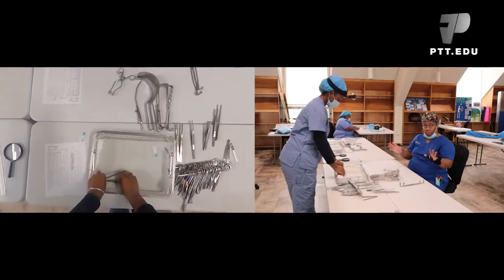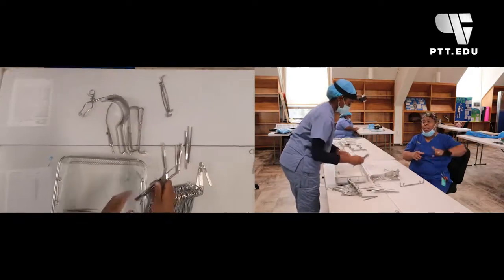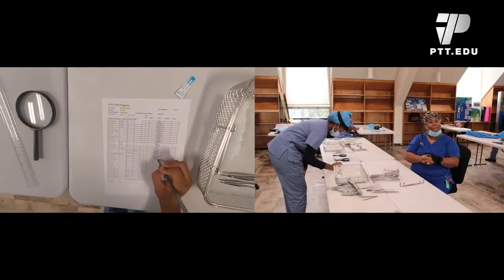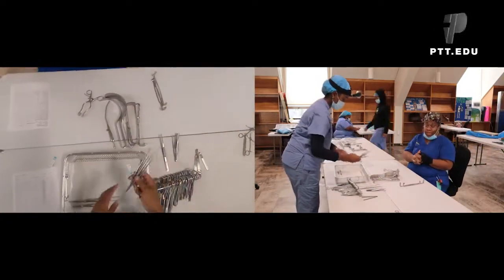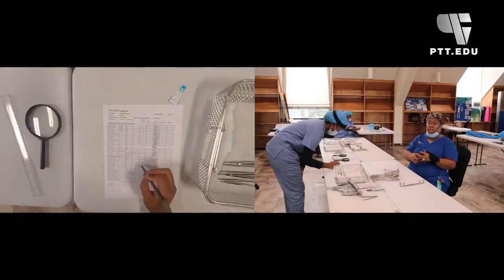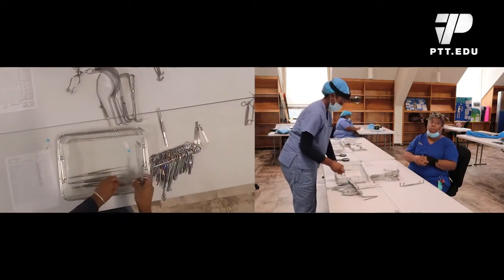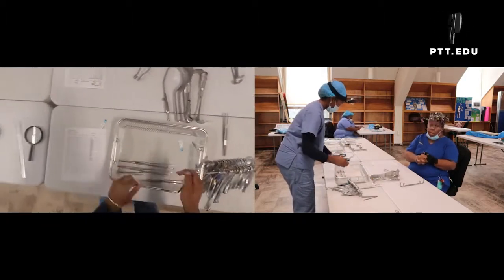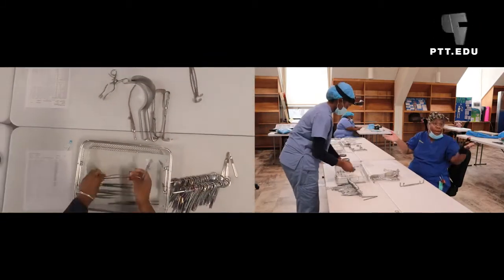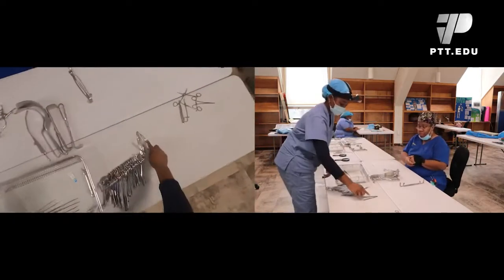Nothing dirty in this room. All cleaning happens in the decontamination. That's where you'll see all the remnants of the surgery, I should say. It's not for the weak, but when you're in decon, you get used to it. You're just like, okay, there's a lot of blood, especially if you have orthopedics, a lot of labor and deliveries. As you know, if you have any children, the mamas and the babies, they don't come out little clean buggers. They come out little slippery and red. That's what happens when you get birth and you have children. So that's what we're doing.